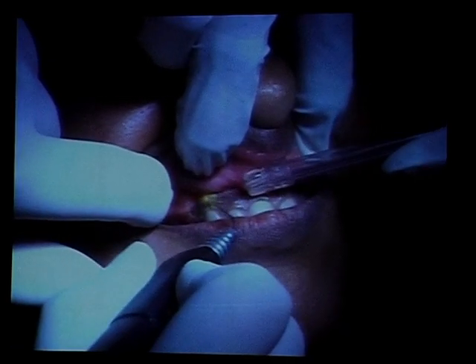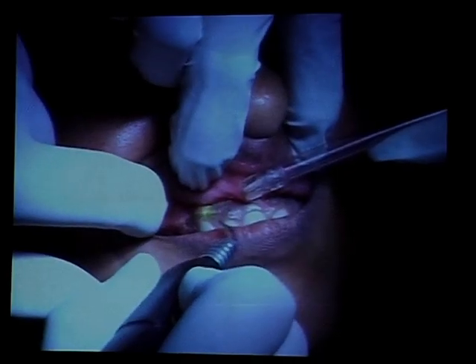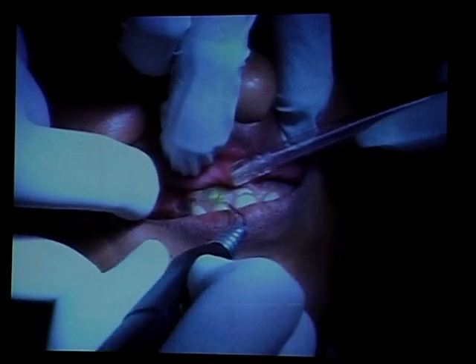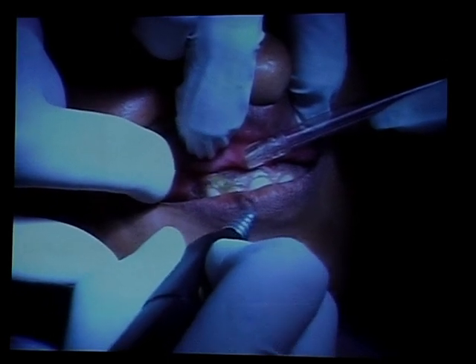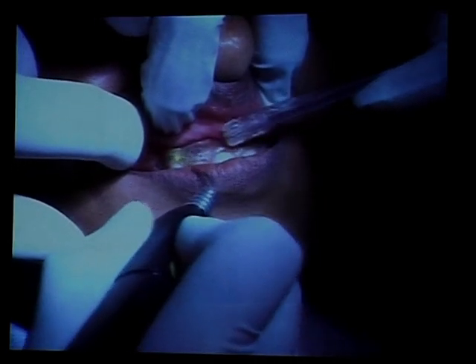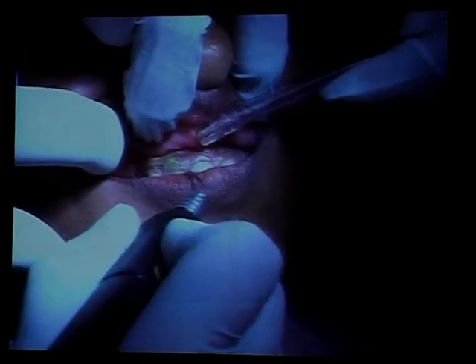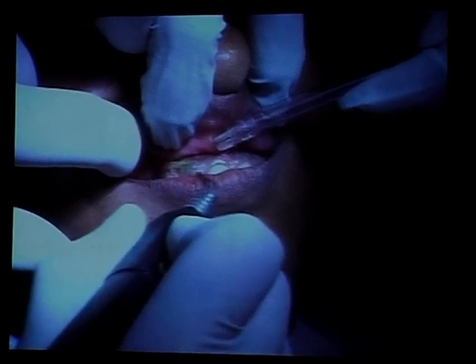And you can see, even if there is only 0.5 watts, it works very well. You're just slightly touching the surface and removing the upper parts of the tissue until you reach the pigmentation.